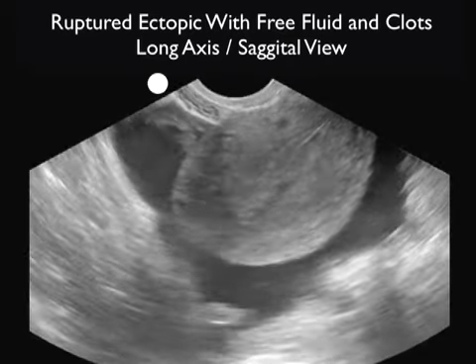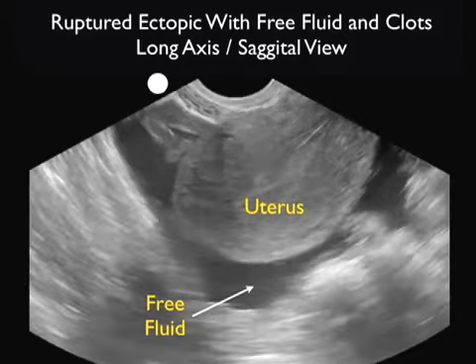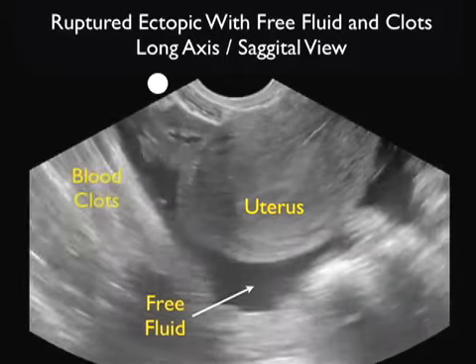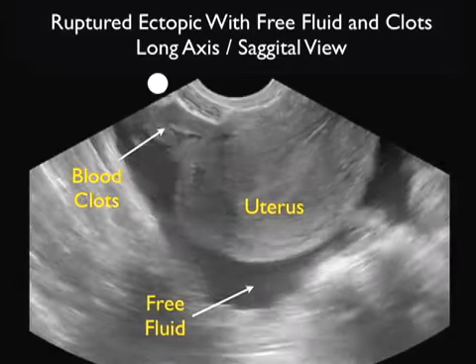Let's begin by looking at some video clips from patients with ectopic pregnancy, starting with this one. This was a patient who presented with a positive urine pregnancy test, vaginal bleeding, and a large amount of lower abdominal pain. We're looking at a transvaginal long-axis view here, and we see the uterus in the middle of the image. We fail to appreciate an intrauterine pregnancy.